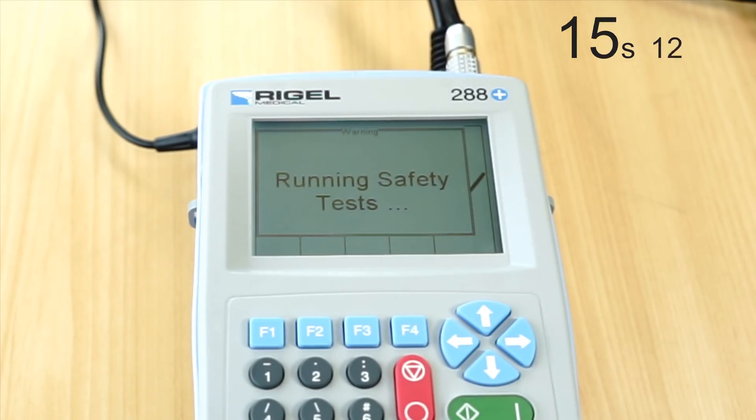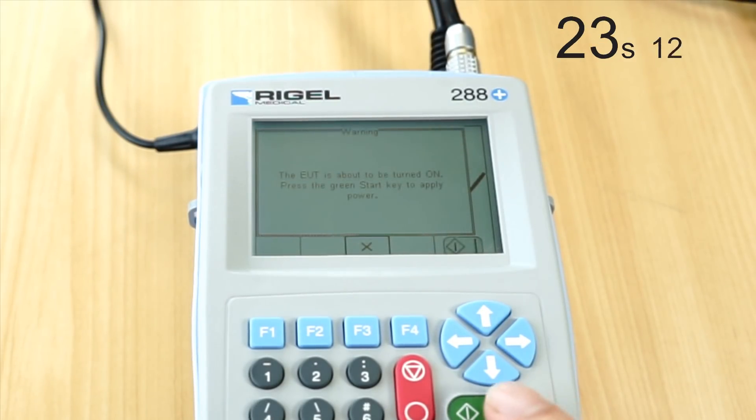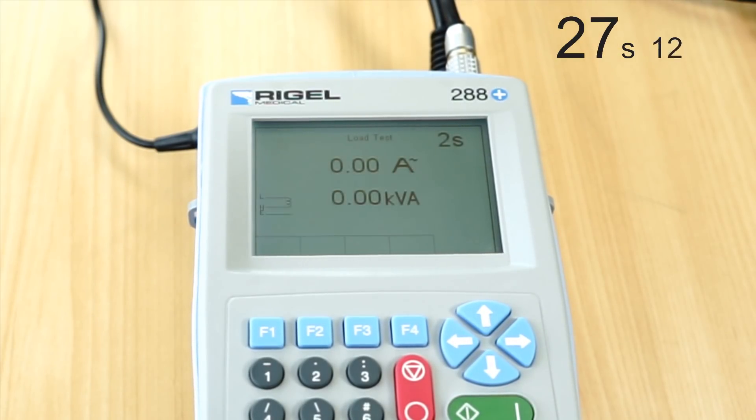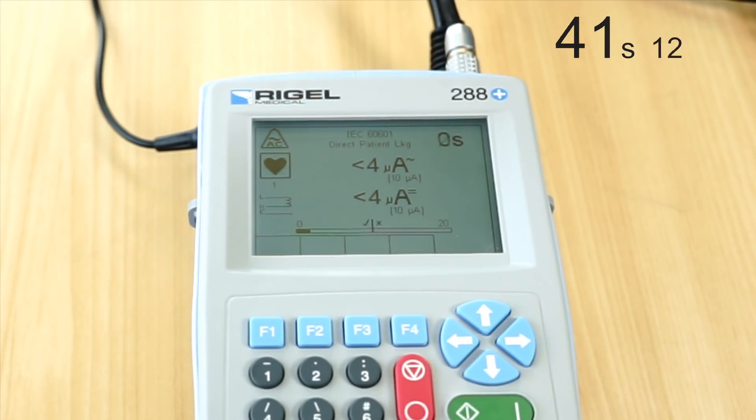The device will give us readings and go through each test sequence in order: earth bond, then a run test which measures the functional current of the device, then it will proceed through earth leakage, enclosure leakage, patient leakage, patient auxiliary leakage, patient F-type leakage, and go through all of the single fault conditions.